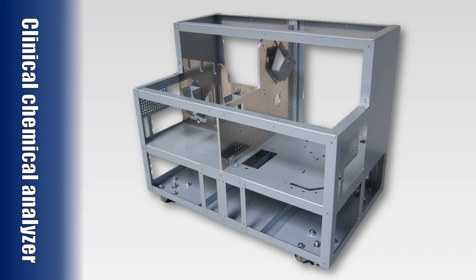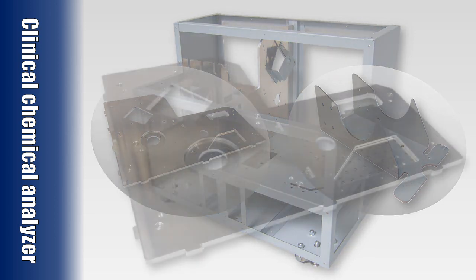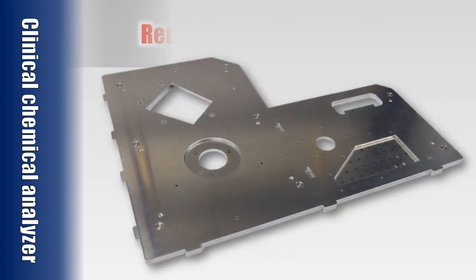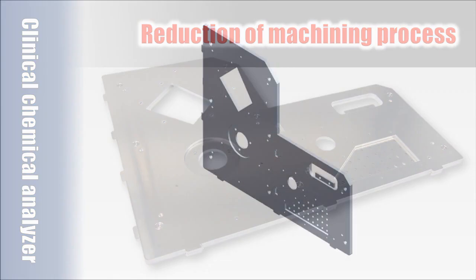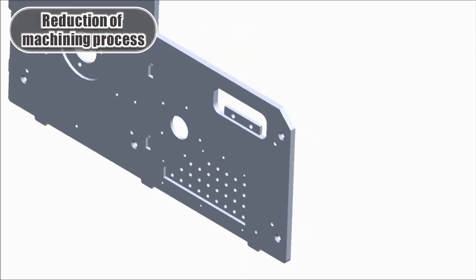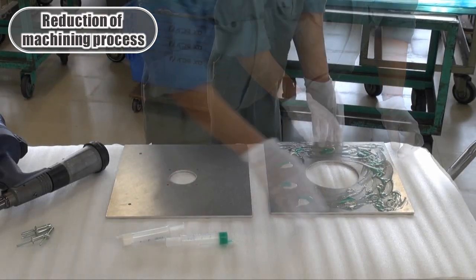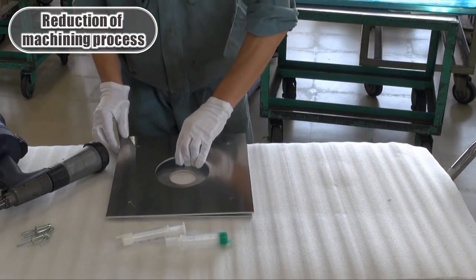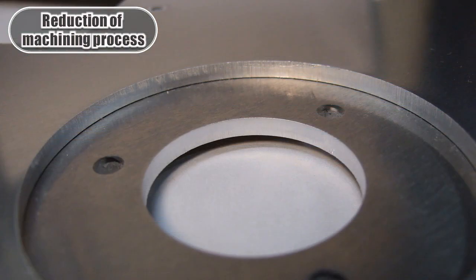First, let us introduce 2 cases for the clinical chemical analyzer. For the first case, we'll take the aluminum partitions used inside the frame as the example to show how we can reduce machining processes. In this example, we replace the machining process of 8 mm thick aluminum part to sheet metal processing by using 2 sheets of 4 mm thickness each. Please take a look here. The 2 sheets are laminated, and by making holes and notches in just one sheet, we can make the same shapes with the sheet metal processing.